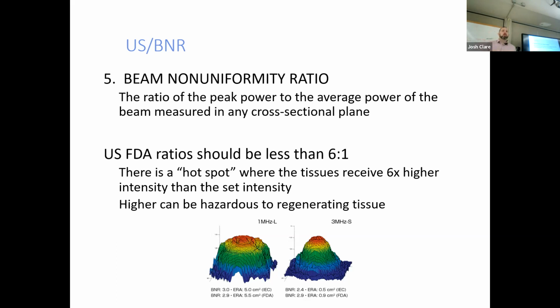So the big thing for ultrasounds, the hands-on practical, how do I do this? The number one thing we're going to be looking at is making sure you're always moving that sound head as it's applied to your patient. It has to be moving. One, because we don't want one hot spot staying in the same place the entire time. Two, we don't want the collision of these sound waves creating a problem. We'll look at what that is in just a little bit.